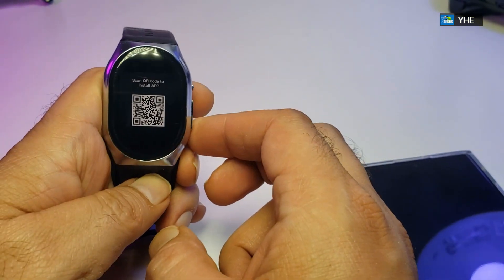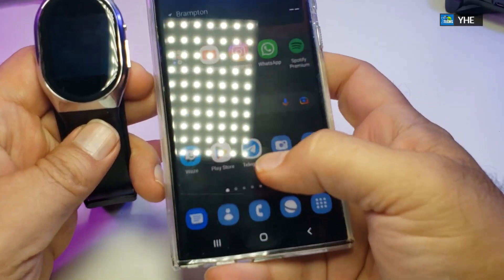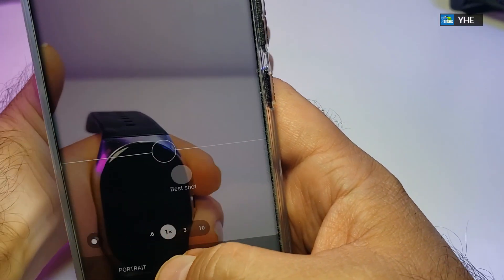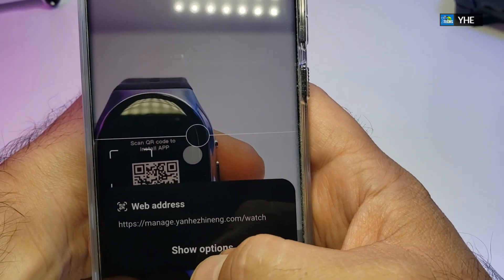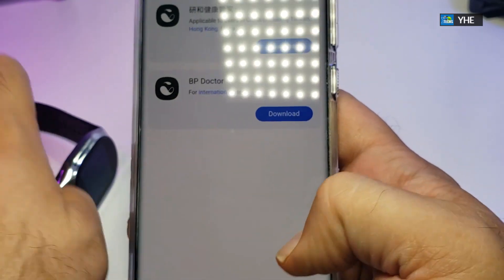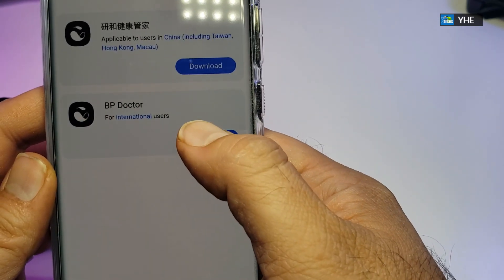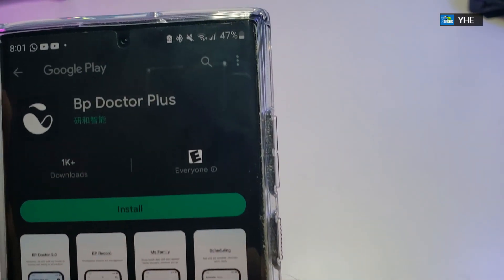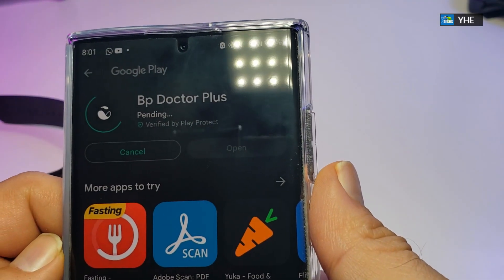Now let's get it connected. We are going to scan the QR code. For that we have our Galaxy S22 Ultra on hand. We brought up the camera and scanned the QR code. It automatically goes to the website to get the app for us — the English version is called BP Doctor. It automatically takes you to the Google Play Store and we click install. It takes a couple of seconds to install.